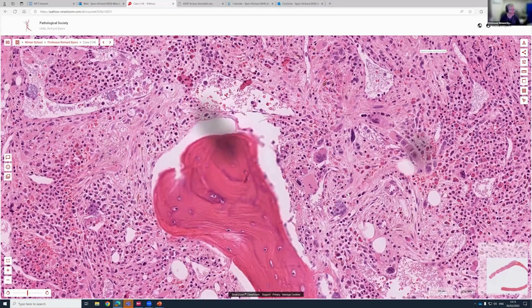It can be secondary to essential thrombocythemia. You can also get pre-fibrotic and cellular phase myelofibrosis, but this is clearly fibrotic. The key feature is the atypical clustered megakaryocytes. And also in the fibrotic stage, this clear collagen fibrosis.